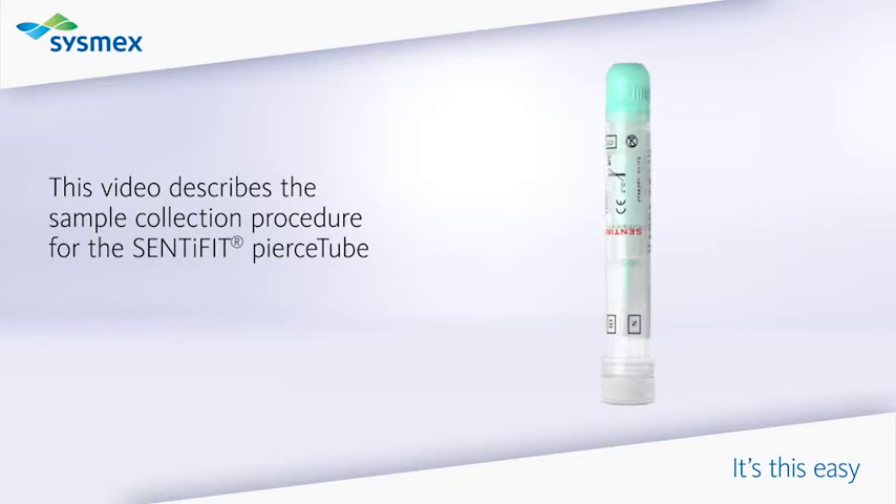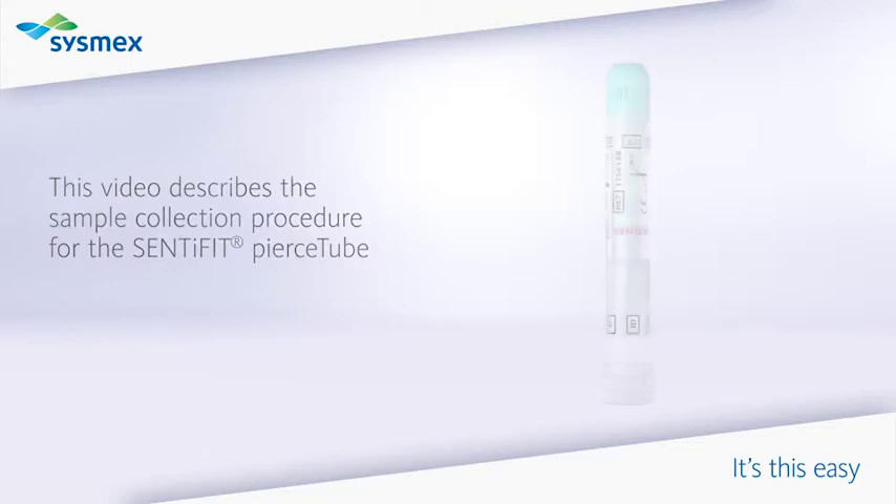It's this easy. This video describes the sample collection procedure for the SENTiFIT pierceTube.